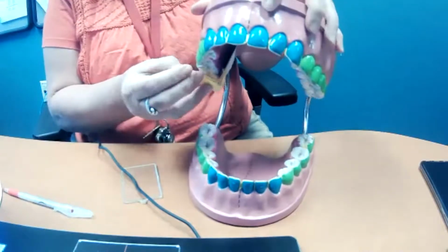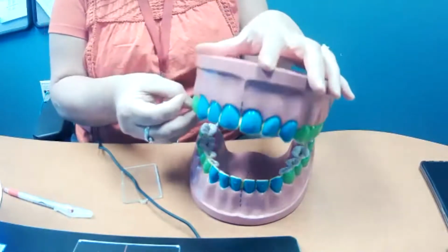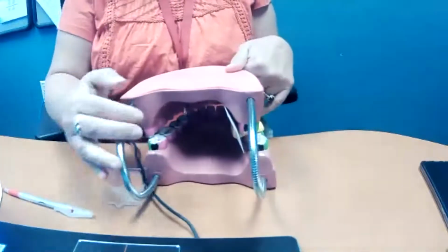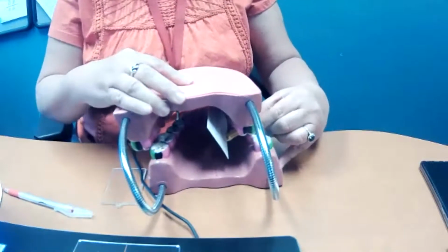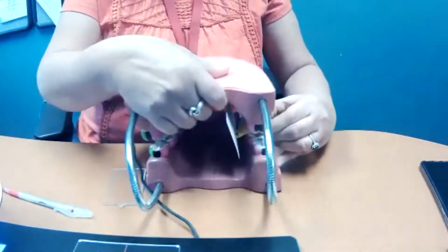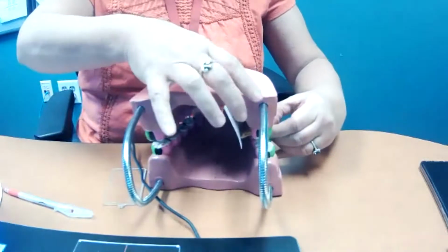Now, if I put it in and it's too close to the teeth, what's going to happen to my film is that if you look here, you see how my film bends because it's too close to the teeth. So what I need to do is put it more into the middle of the patient's mouth, because the height of the palate is in the middle, the film's not going to bend.